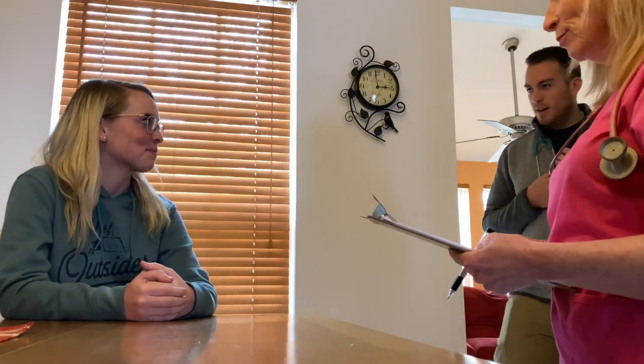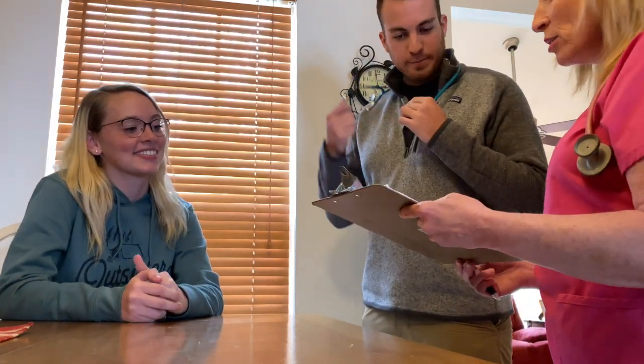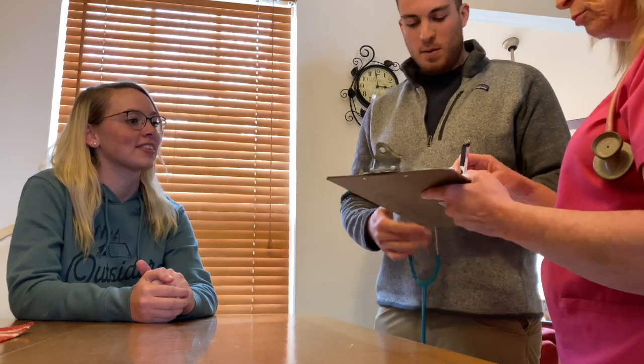Hello, hello. How are you doing today? Sarah, right? Yep. All right. What's happening? What is she here for? Well, Sarah's here for a physical. Okay. Her blood pressure is within normal limits, 124/80. That's outstanding. Just wondering, did you want me to do an EKG on her since she is here for a physical? Yeah, that sounds good. If that's okay with you, we're gonna get an EKG done, make sure everything's in rhythm, everything's working correctly.